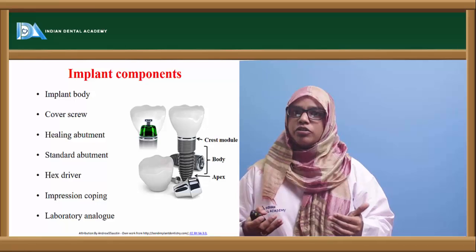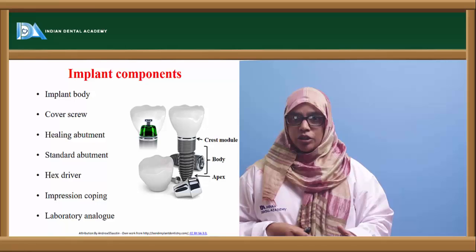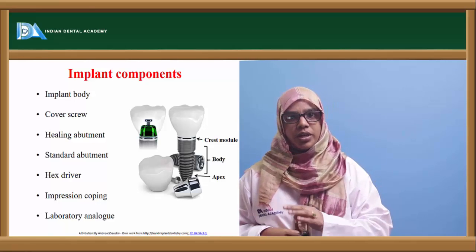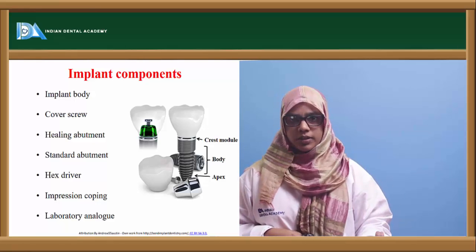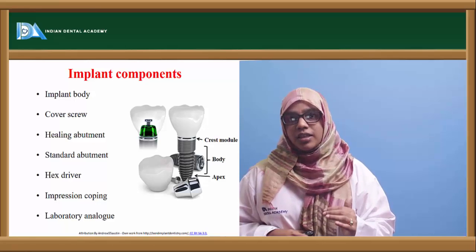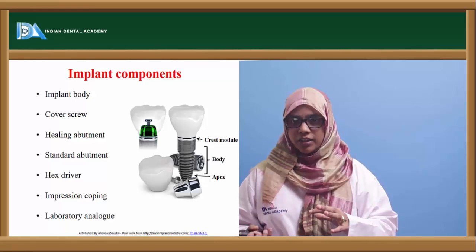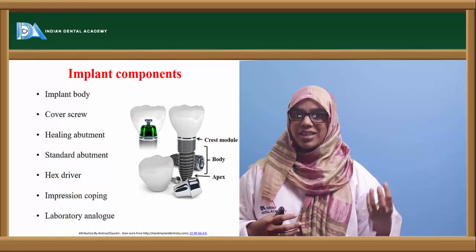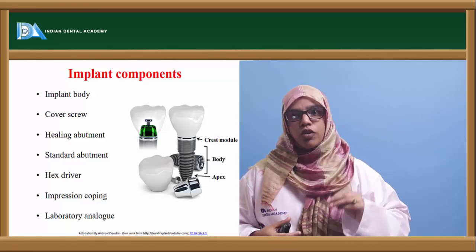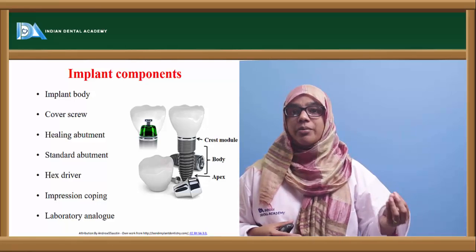So, you cannot have the patient continuously at your clinic. You have to have a simulated cast. To have a proper position of the implant in the oral cavity, you will put an impression coping and then transfer this impression coping over the cast. Then comes a lab analog. Lab analog is nothing but an implant that will simulate the implant in the bone onto the cast, that goes inside the cast. That is the lab analog. Because your impression coping has to sit on something in the cast, it will sit on the lab analog, which will mimic an implant in the cast.